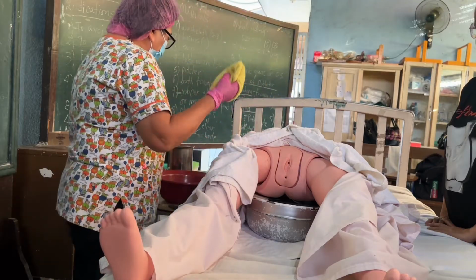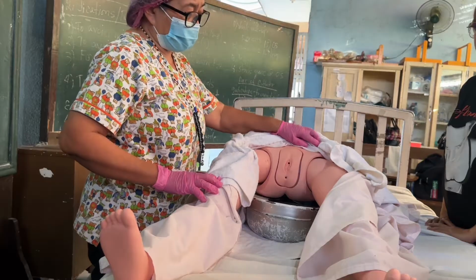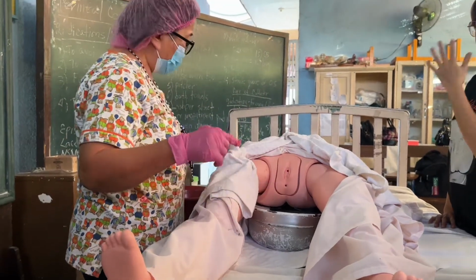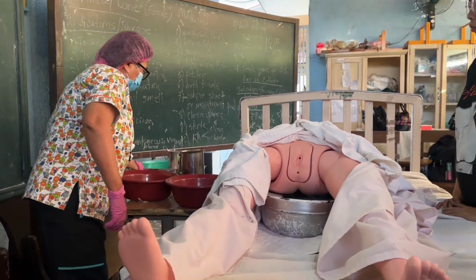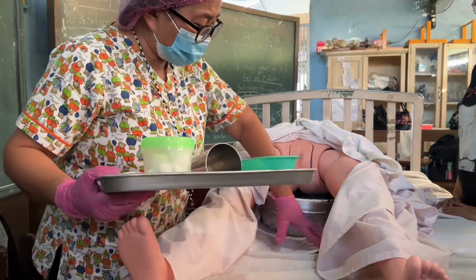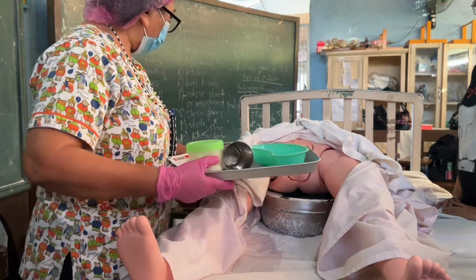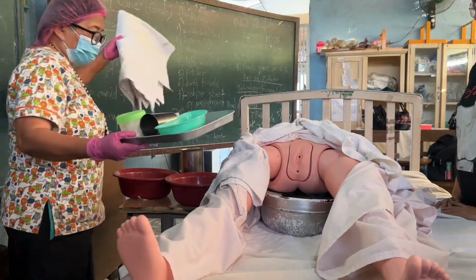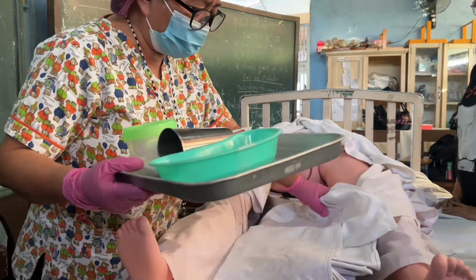Okay? And then we're now going to proceed to sterile technique. So we're done with the external part of the perineum. Now we're going to clean the center using the sterile technique. So you need an additional pad or additional towel. You can put the incontinent pad here. So everything should be padded, class, to avoid additional soiling.